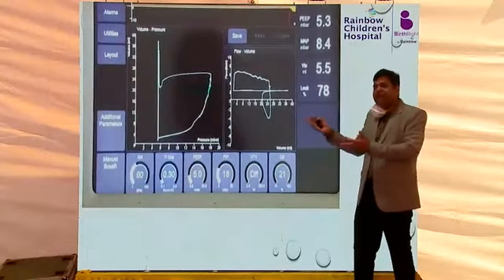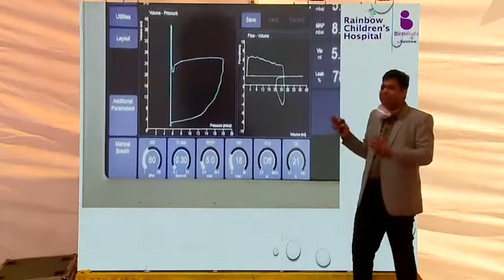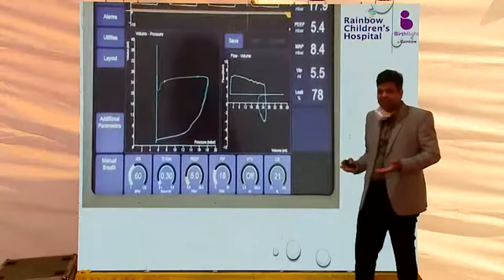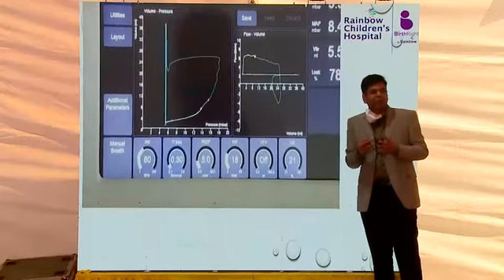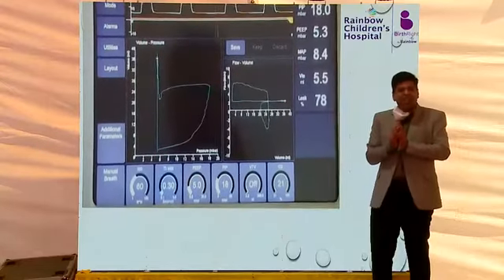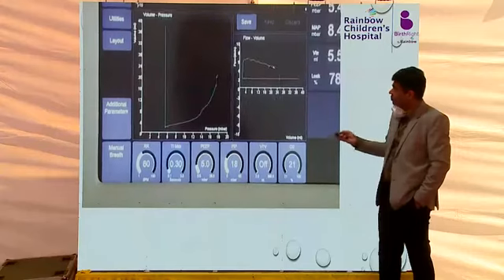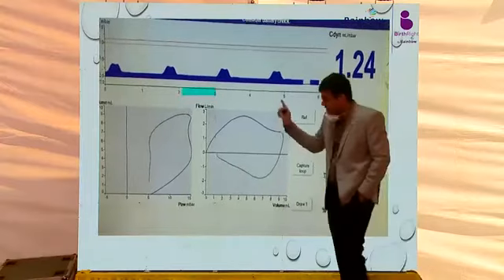You can see it by flow and volume, and this is so easy, right? You time the leak is happening and you do a minor change in the position of the endotracheal tube, a minor change in the position of the neck, and see that the leak subsides, right? And your child will start saturating better. So by minimal things, the basic point of the pulmonary graphics talk is that you can identify simpler things, and sometimes you don't need to subject the child to too many interventions.